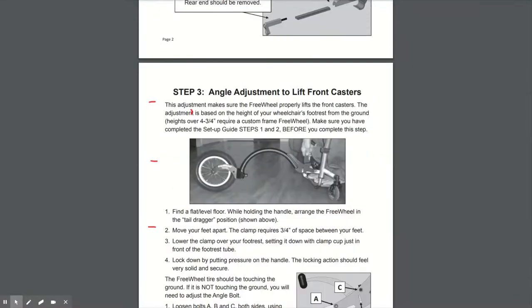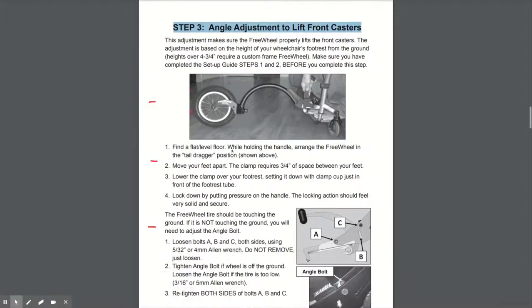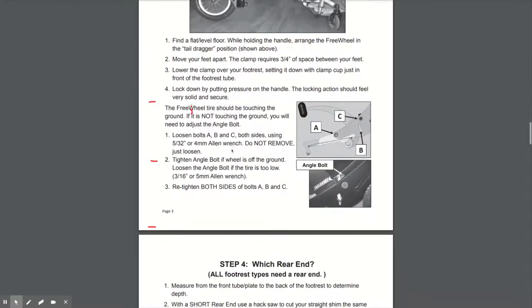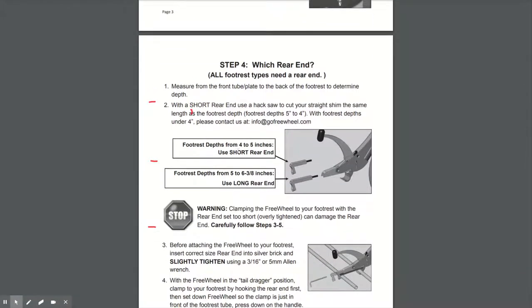You then come to step three, which is around angle adjustment of the front casters. Our advice is to go to step four first, which is determining whether you need the long or the short rear end. Now in the box, you'll have a bag of parts which will include two rear ends, short and long.